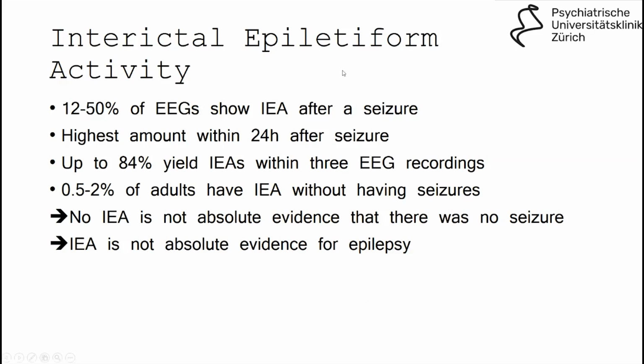If you have interictal epileptiform activity and it correlates with the clinics, you've got to do something about it. However, if you don't find anything in the EEG, that doesn't mean that there is nothing.